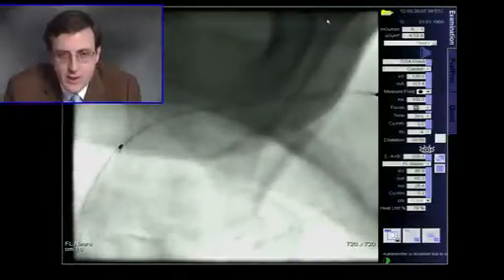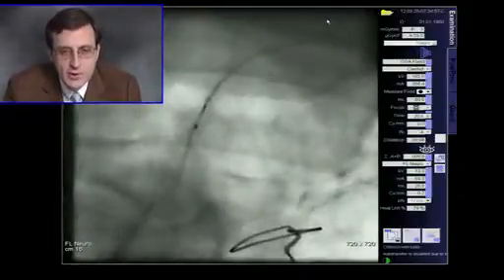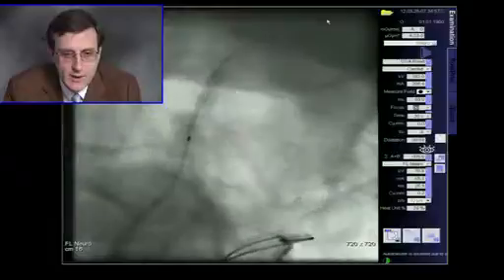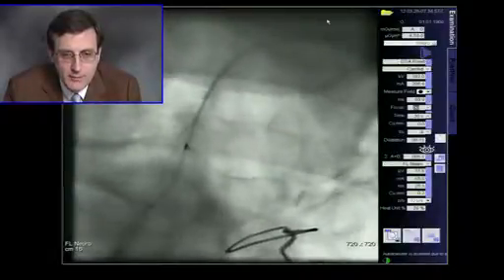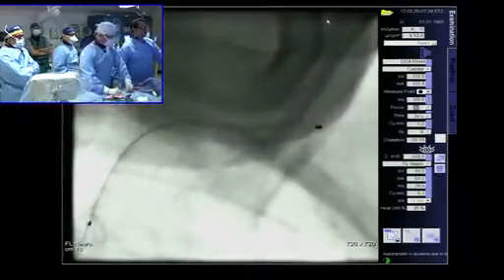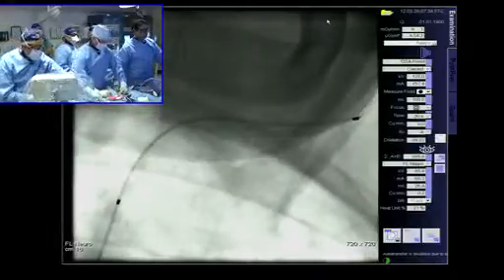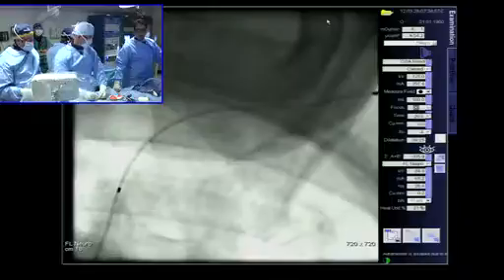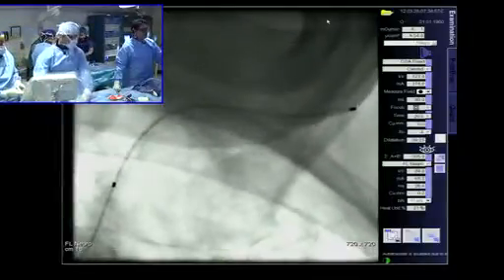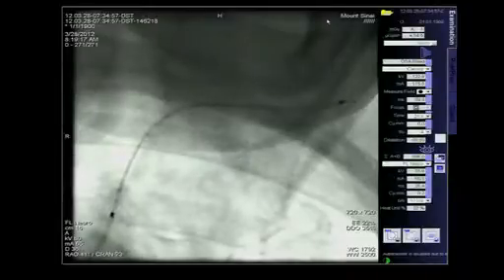Unfortunately, there's a little bit of a branch of the subclavian that the wires tend to go into. We saw it in the glide wire positioning as well. There's kind of a natural course of a wire. We'll walk this wire out, walk the balloon out. So what we're going to do now is get the wire as distal as possible, taking the Aquatempo and really going on the stiff part of the wire, which we should have done earlier, because if you saw the way the wire behaved, clearly there's an issue. And again, that's another reason to learn from the characteristics of the lesion as you do your intervention. So we're going to go back with the Aquatempo and place this quite distally.